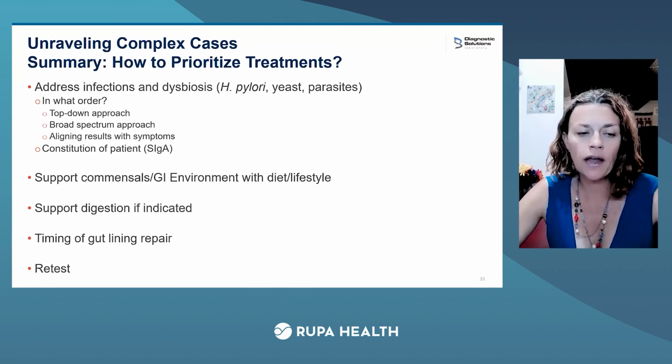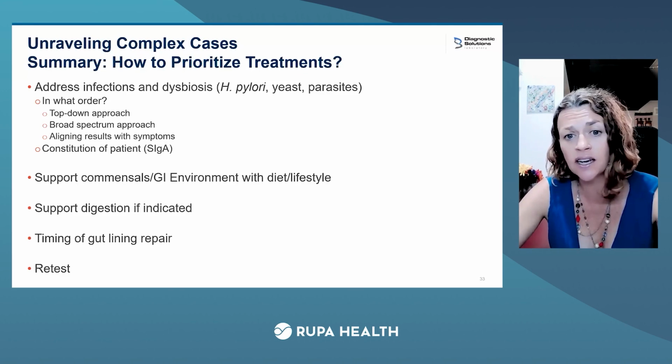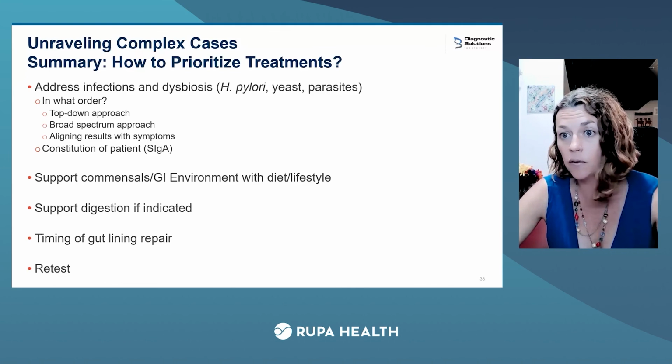Awesome. Thank you to you both. And retesting here is a bullet, and there's different philosophies on this. I would say in both of these cases, there's certainly enough dysbiosis and infections and co-infections that personally, I feel like both of them would warrant a retest down the road after a protocol is finished. I think Amy mentioned you can run just page 1 of the GI map, just the pathogens panel as a standalone. If money is an obstacle, that's always an option to keep the costs a little bit more affordable.